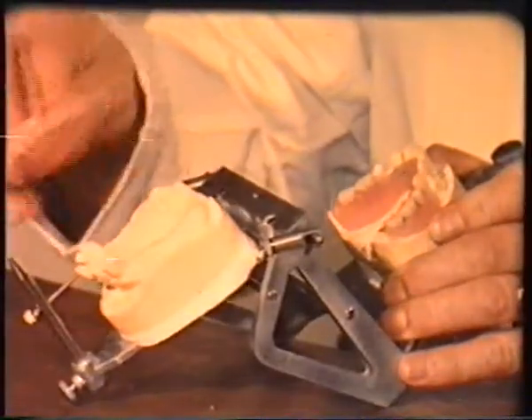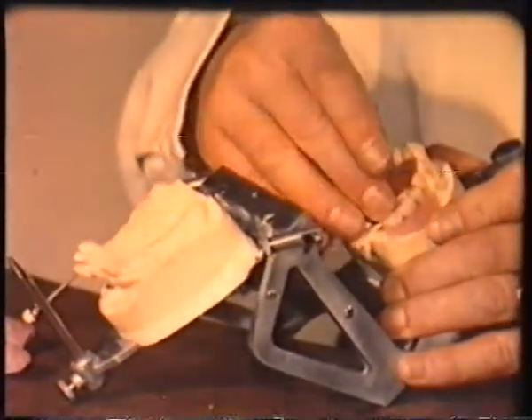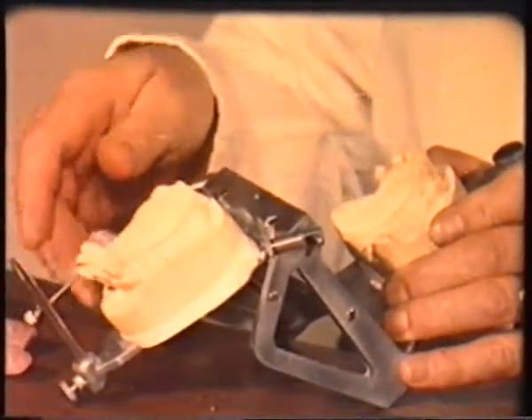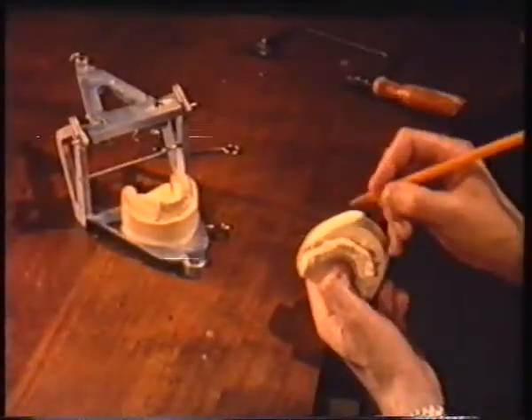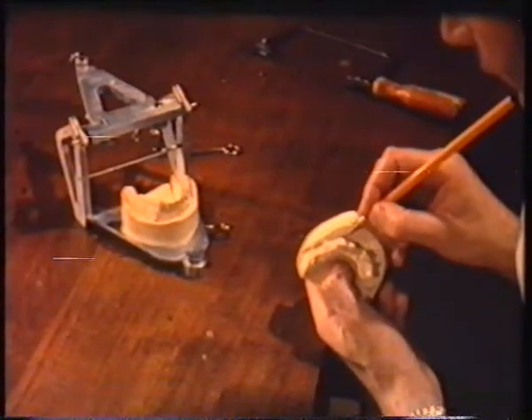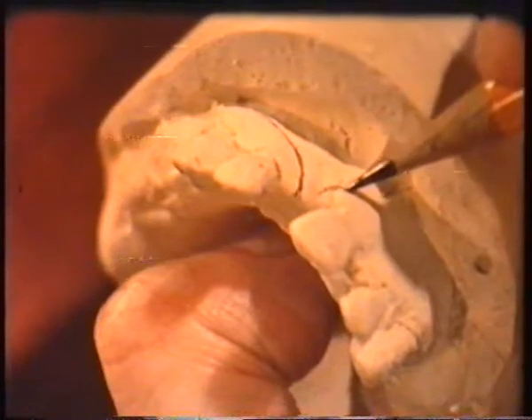When the dentist is satisfied with the try-in, the wax partials are returned to the technician for the laboratory work to be concluded. The first stage is for the dentist to mark on the models with indelible pencil the mucogingival line.